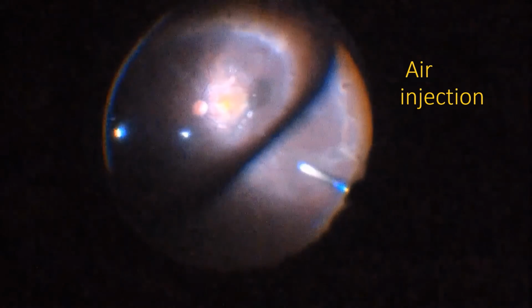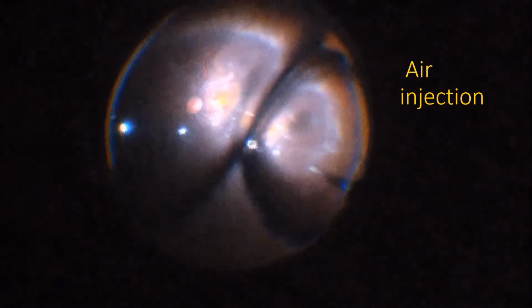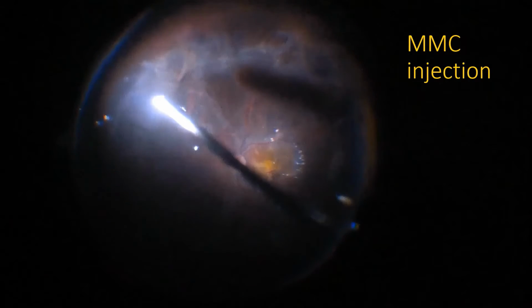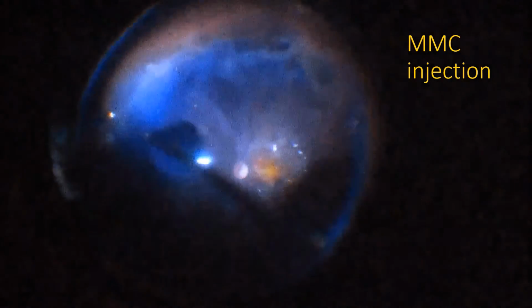Next, a fluid-gas exchange was performed anteriorly to create a cushion bubble for the protection of anterior structures such as the ciliary body and the lens from the mitomycin C. The dye and mitomycin C was infused directly on the retinal surface and allowed to remain in contact for about 30 seconds, after which it will be washed out.